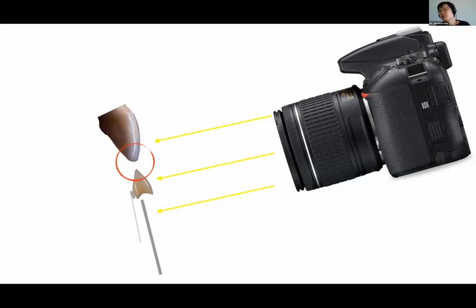But also, I know a lot of people recommend flipping the shade guide so the cervical is facing the tooth, and they grind a shoulder in the cervical area. Basically, they butt up the shade guide against the tooth, which is fine because it makes it more stable, and you can put it on the same perpendicular plane.